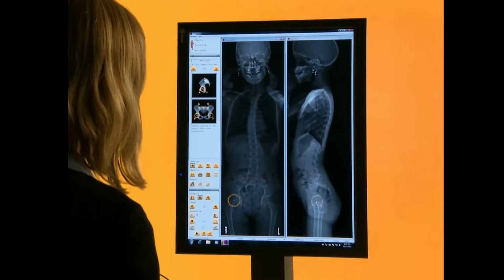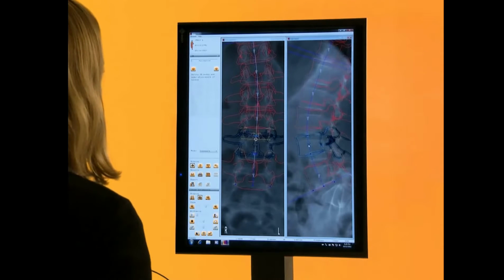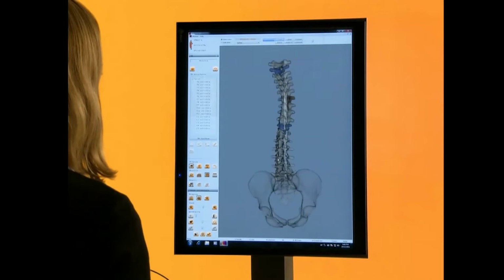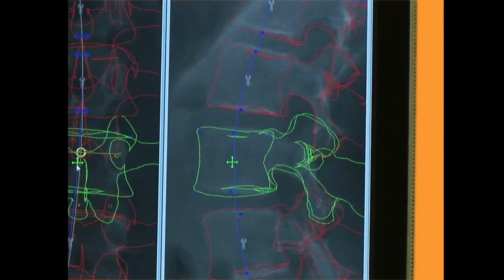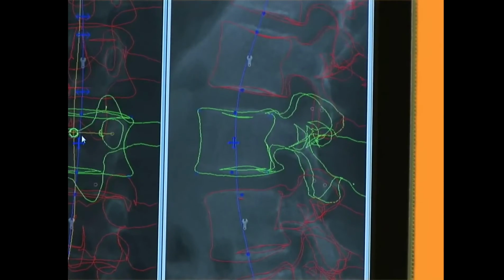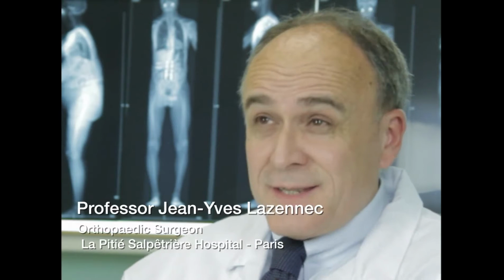It gives us the possibility of doing a 3D reconstruction of the whole spine in a standing position using only 2 views, the PA and the lateral. We can get a 3D reconstruction of the whole spine with the intermediate structures, the disc space, and the vertebral bodies. So when we put those two images together, we find that the EOS reconstruction is really very, very accurate. Within a millimeter of position and within a degree or two of rotation. I have been using this technology since 2006, and I have experience with about 3,000 patients.